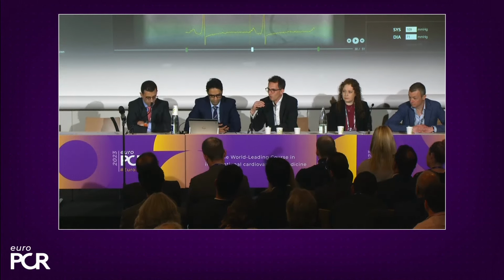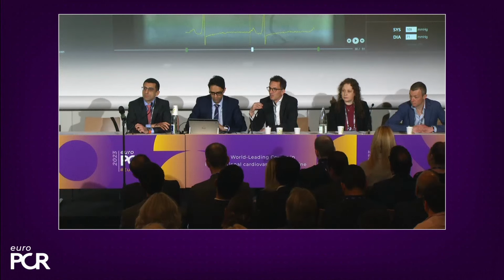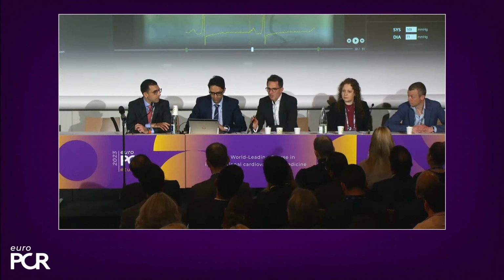Yes, actually, as you said, the more distal you get, the lower is the pressure. And this is the true pressure. And I guess you see this phenomenon with both techniques. So we have to take a longer segment to have a more precise evaluation of the virtual FFR? Not necessarily. We have seen here, in the first example, that the part of the vessel you need distal from the stenosis doesn't have to be very wide.